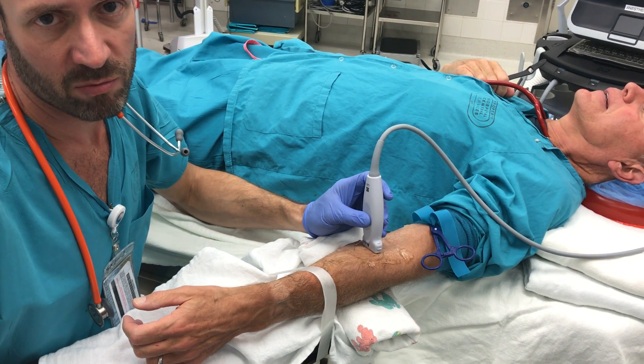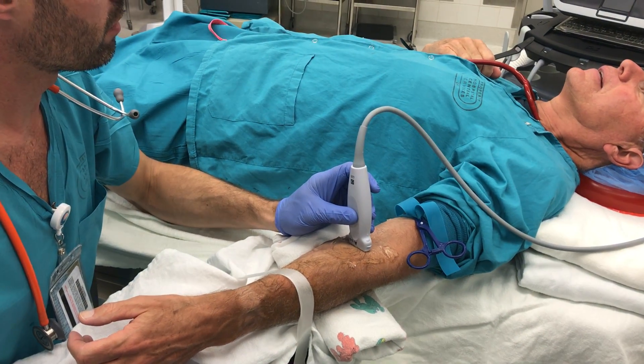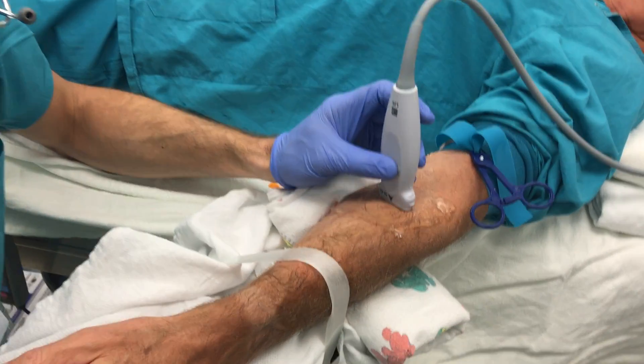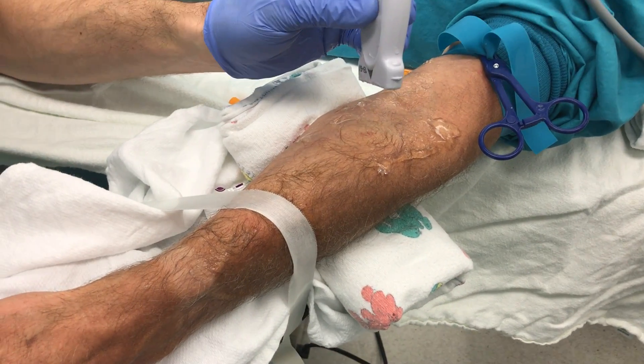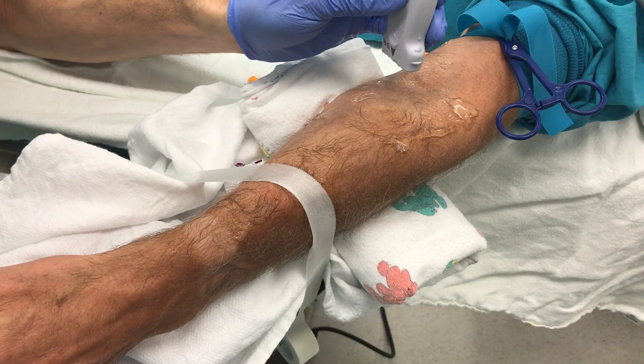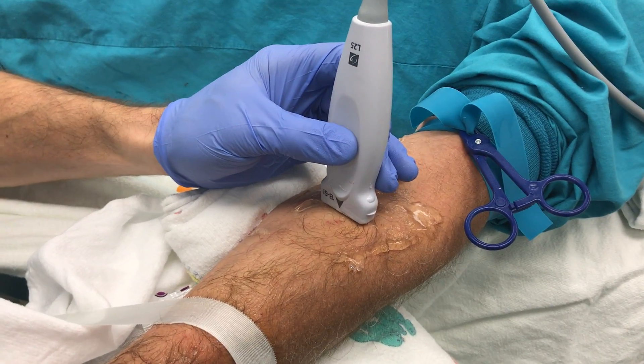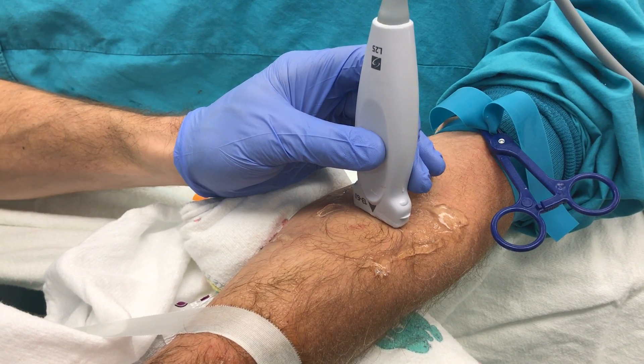I'm going to demonstrate the out-of-plane technique, which I think most people find easier than the in-plane. Really important how you hold the probe — holding the probe nice and low, with my little finger anchored on the skin, so I can hold the probe just hovering over the surface of the skin, barely touching it.